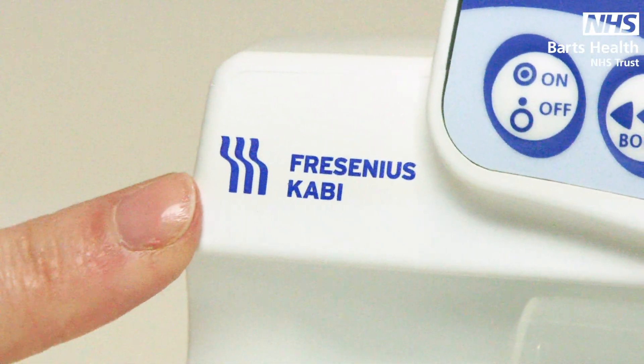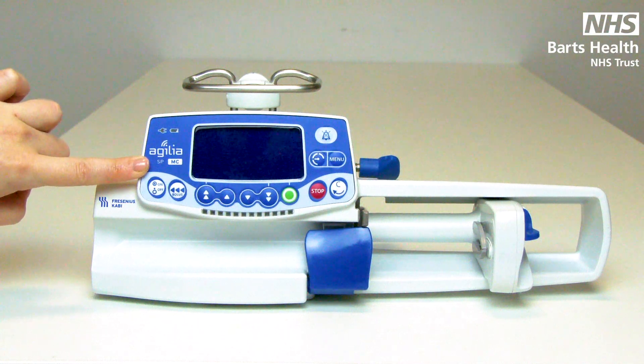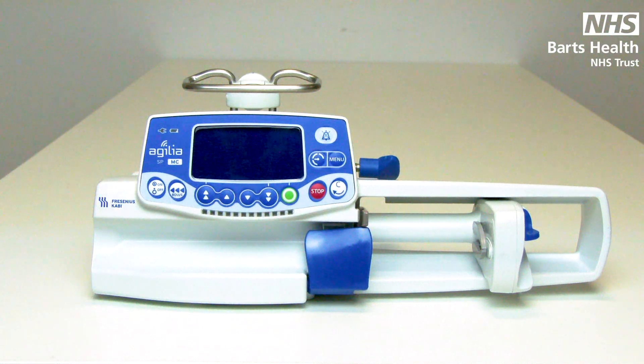Here we have the Fresenius Kabi Agilia SP syringe pump. It's from the same range as the Injectomat and works off the same platform, just slightly newer.